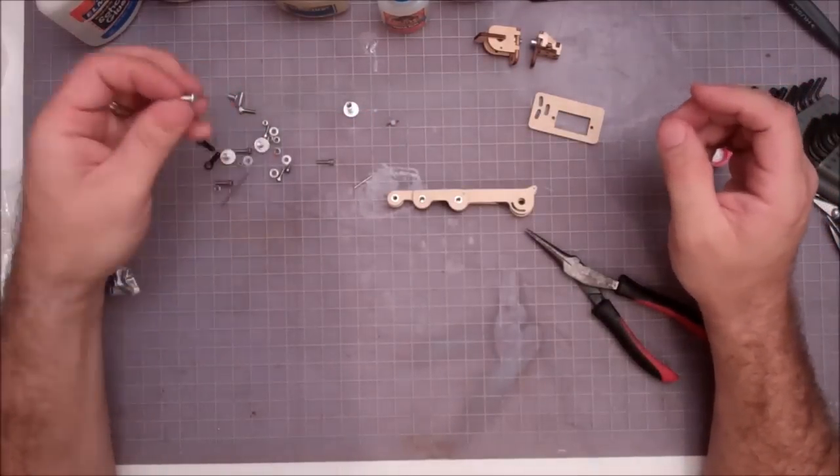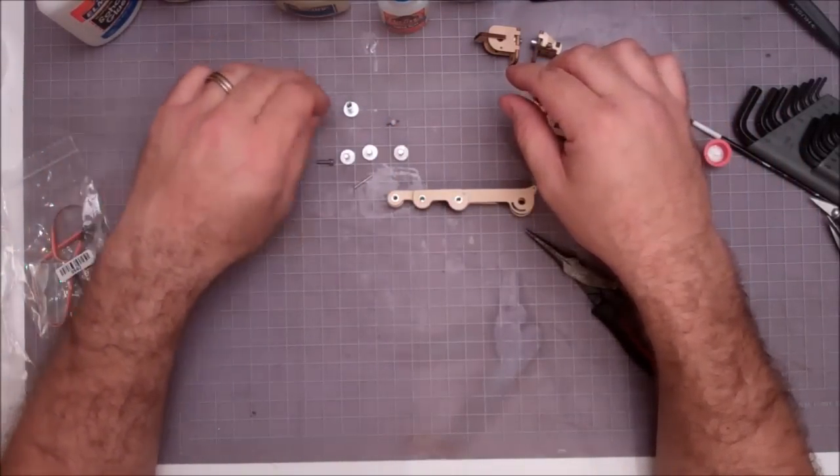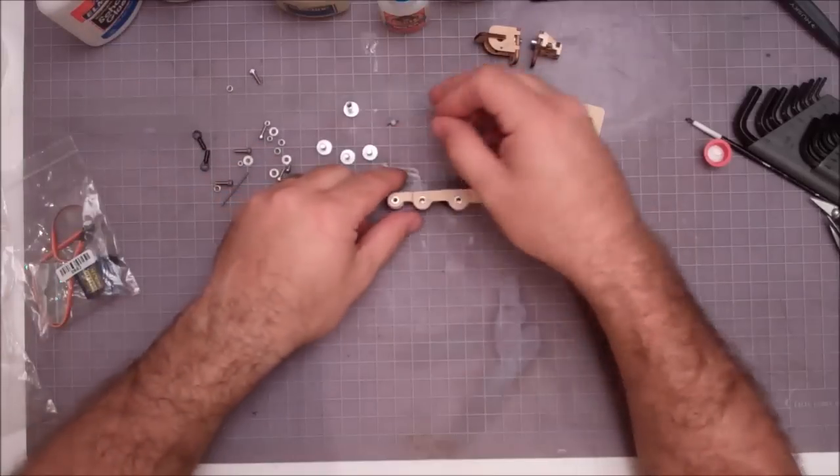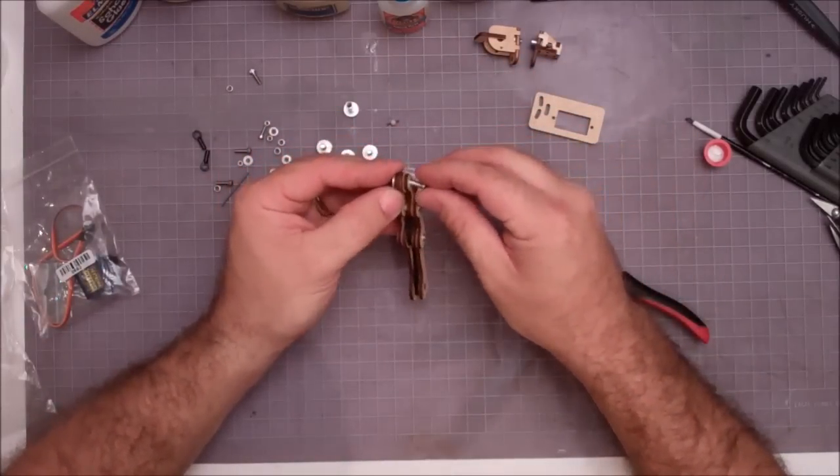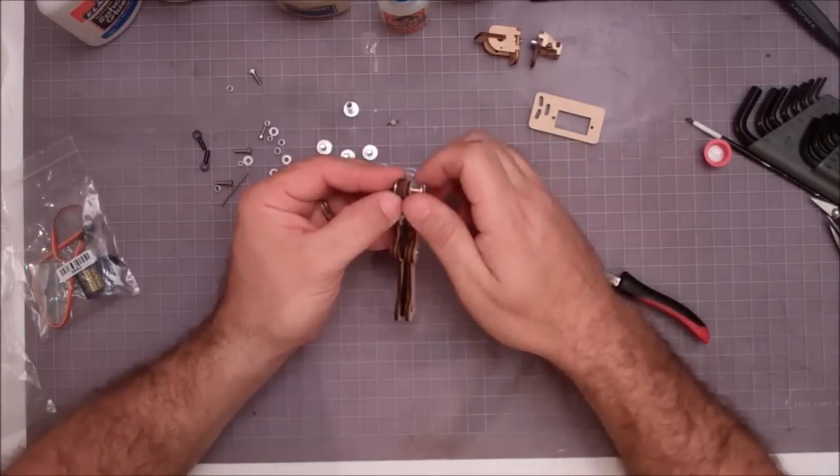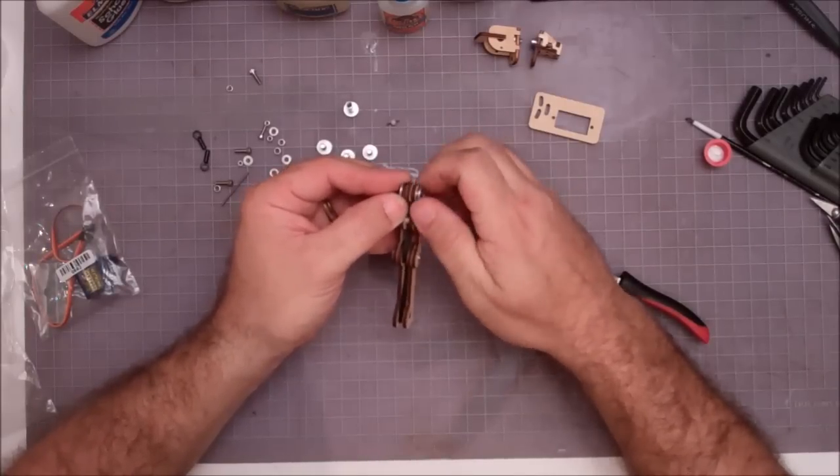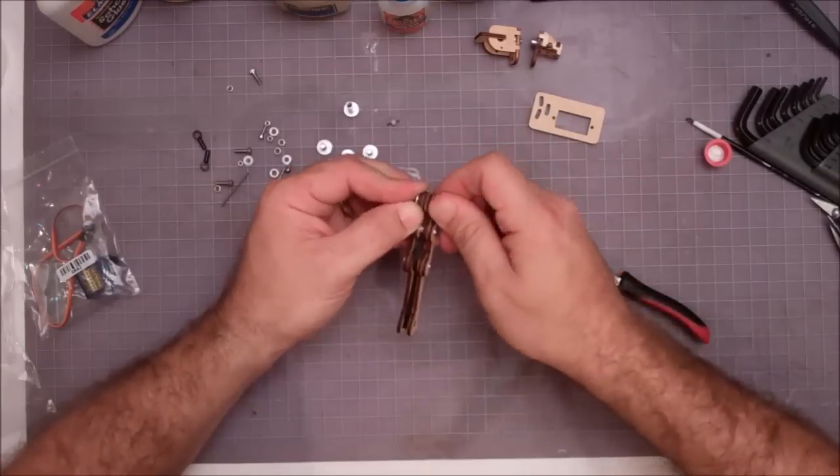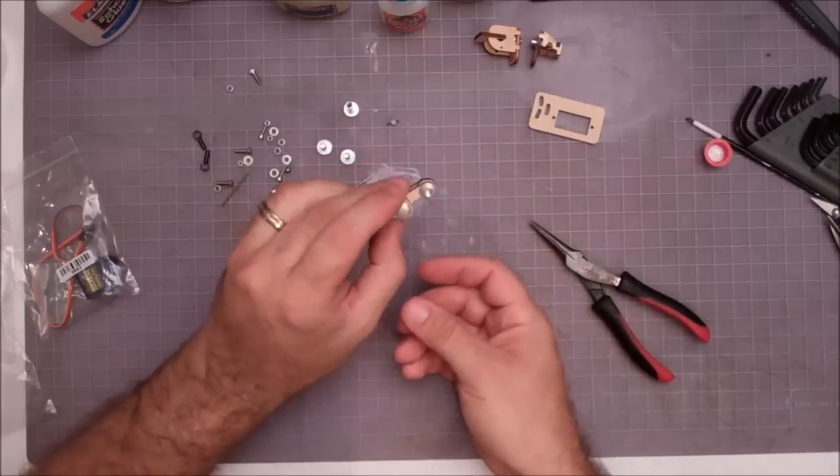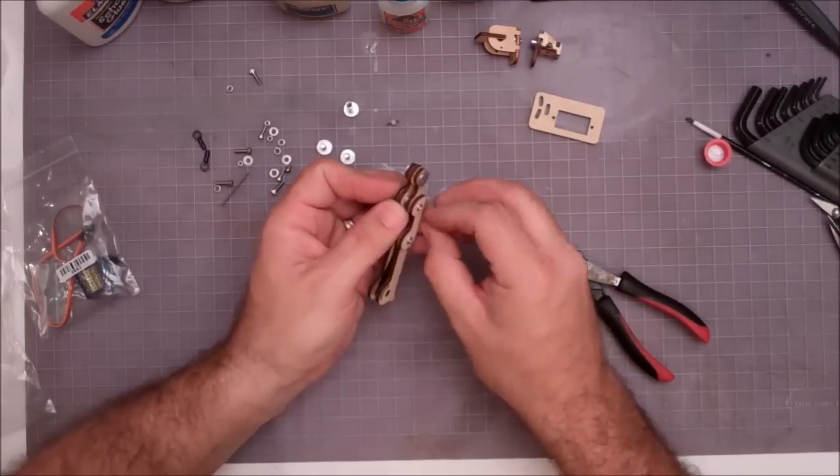Once we've got those sides on, we can then simply take - now the rest of our binding post screws are all going to be the same length, so it's not critical which one goes where. We just take these posts and we screw them in. Just kind of screw them down tight. What I'm doing is I'm pushing my finger against the backside of the binding post as I screw the screw in.